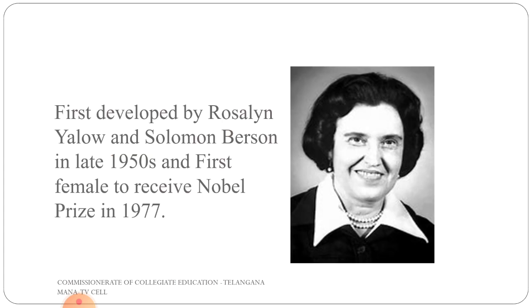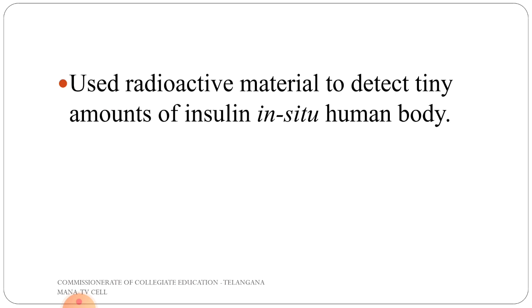Radioimmunoassay. It was first developed by Rosalyn Yalow and Solomon Berson in the late 1950s. Rosalyn Yalow was the first female to receive the Nobel Prize in 1977. They used this technique, using radioactive materials, to detect tiny amounts of insulin in human serum.